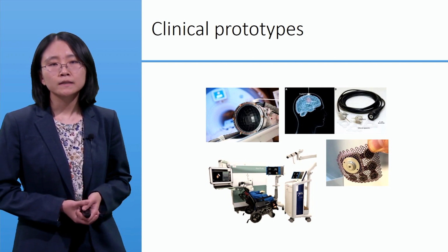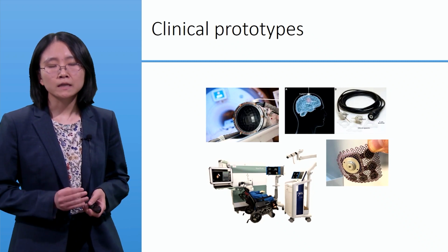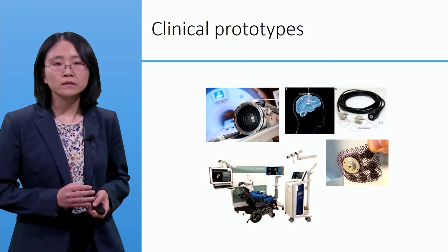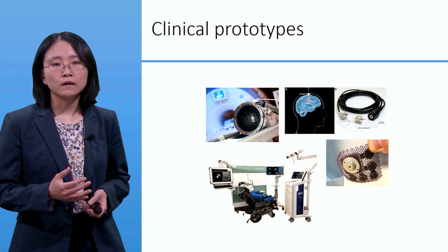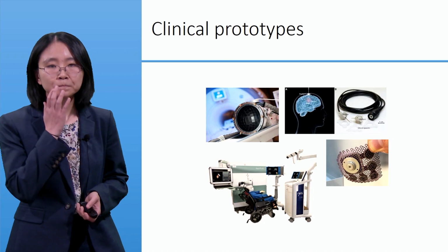On the top right is a system that is implanted directly past the skull, so the ultrasound can directly be delivered to the brain tissue itself.